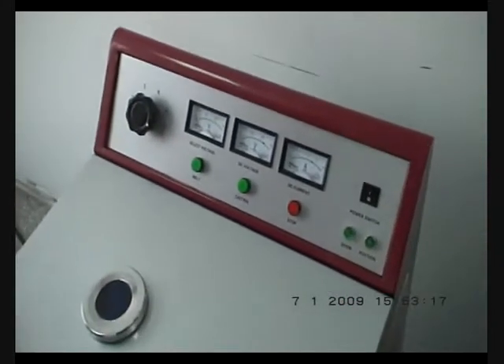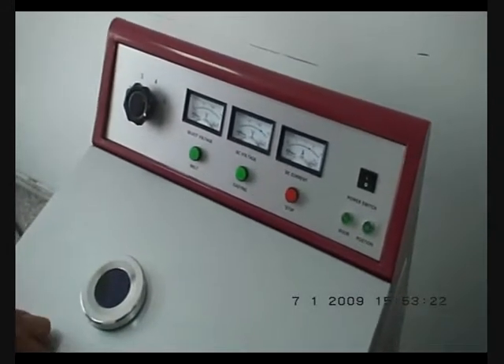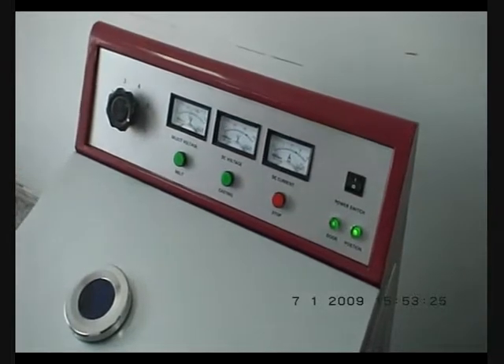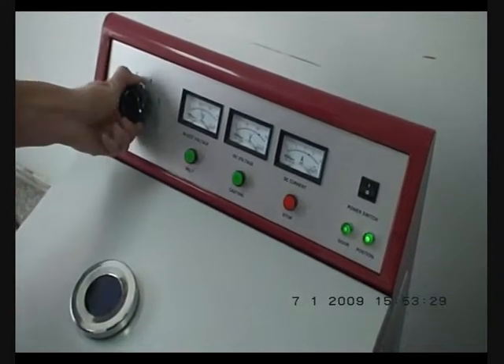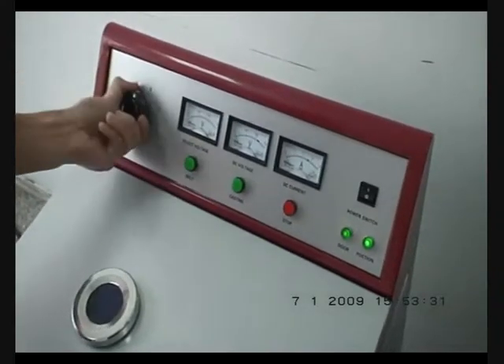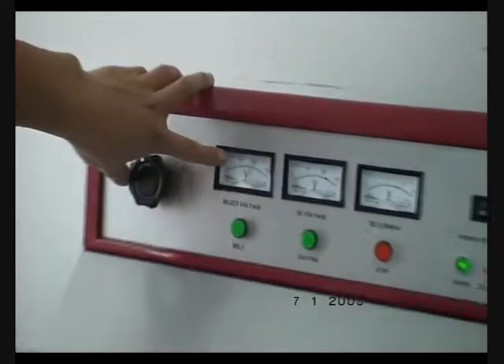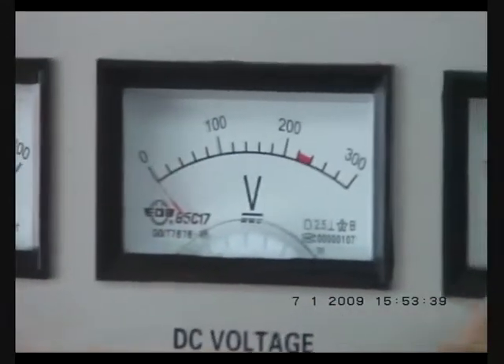If the voltage is 220 volts, first turn on the switch. You have to turn to the third stage. This voltage should be about 180 volts, and this one is zero and this one is zero.